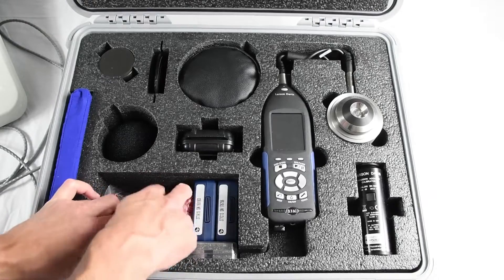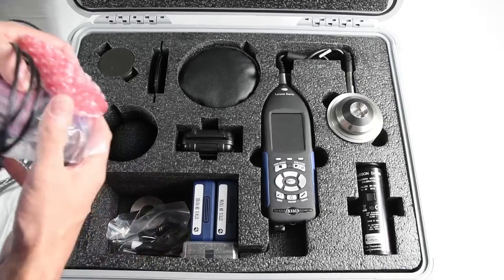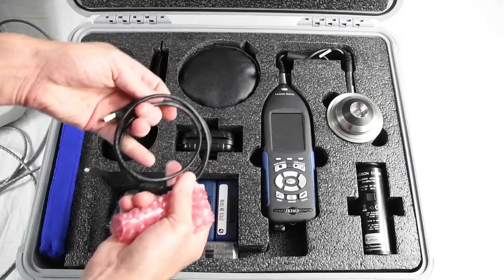Inside the large cavity, there is a cable for direct input signal testing, additional weight for the mass handle, a USB cable with a wall outlet converter along with international adapters, and cases for the microphones and preamplifier.